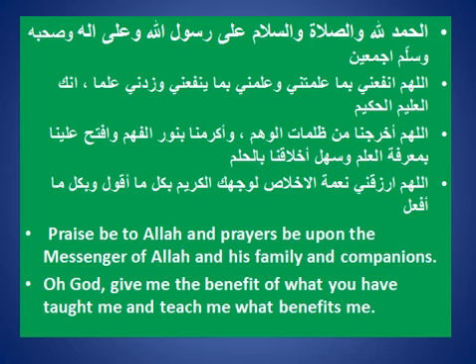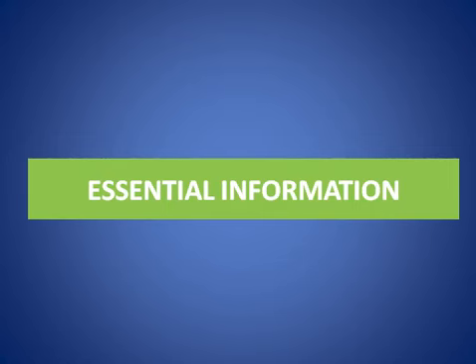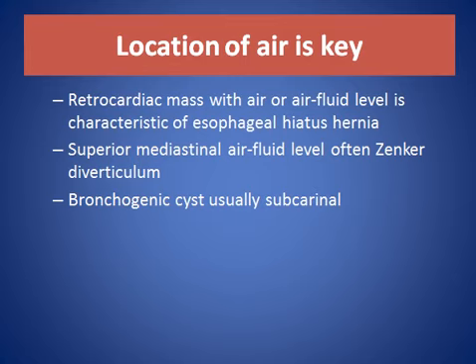My topic today is about air containing mediastinal mass, the differential diagnosis, and a clue to the differential diagnosis. The essential diagnosis is location of the air, where it is located.